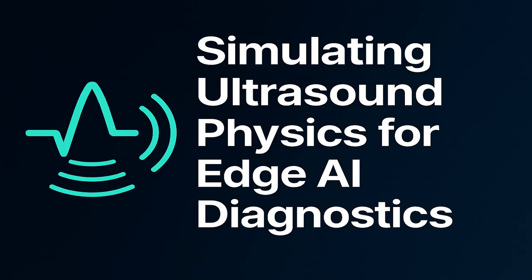Okay, that makes sense. Now for the third, and maybe the most subtle pillar, Rayleigh scattering. This doesn't just reduce energy, it dictates the actual texture of the image. It really does. Rayleigh scattering governs that granular textured appearance that we call speckle, which is characteristic of healthy tissue. And this happens when the scatterers, the microscopic imperfections and boundaries within the tissue, are much, much smaller than the wavelength. Right, when the scatterer size is much less than lambda.